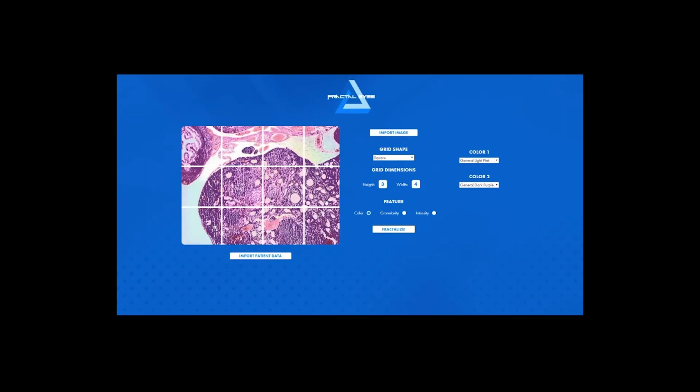Notice how the software divides the images into grids, or image voxels, and exactly picks out the portion of the image that I showed before. The software has also reduced the number of colors from several million to only a dozen or two using a color binning method. This makes the image more conducive to deep learning for the future.